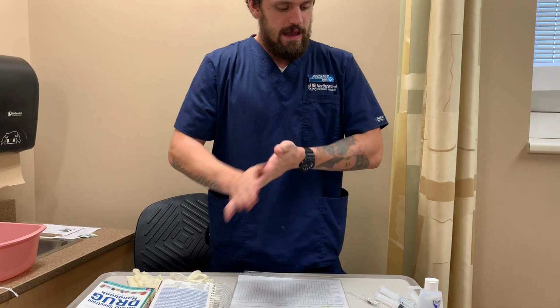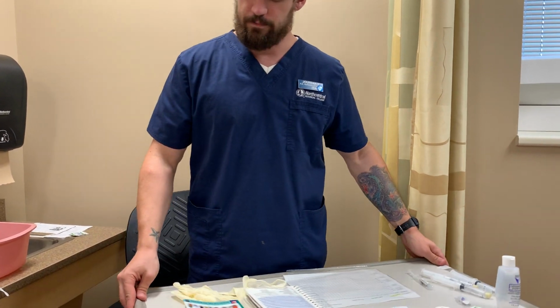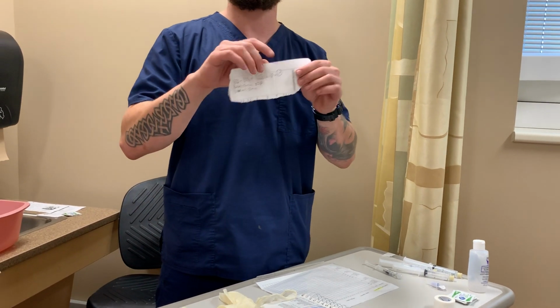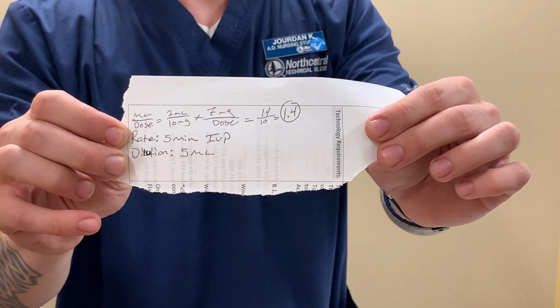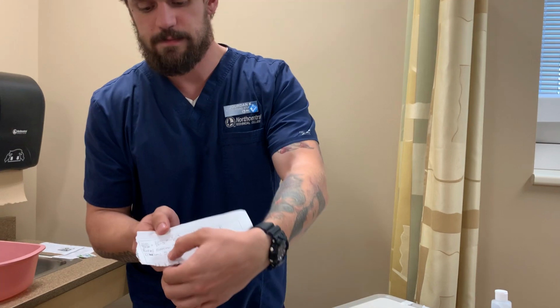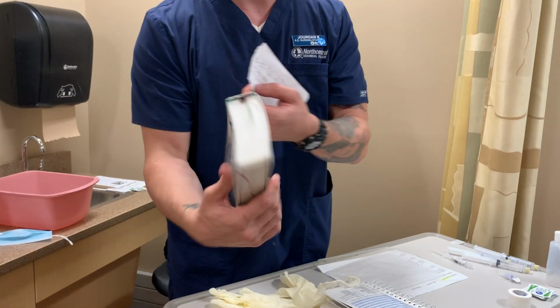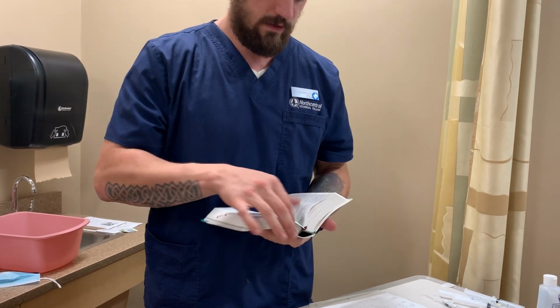Okay. And our med is not in a vial, so we are going to have to waste this med. And in order to do that, I am going to have a second nurse first check my math. That looks accurate. Perfect. And as you see on the bottom here, I do have the rate and the dilution, which I did find in the drug book. And that is easily found.